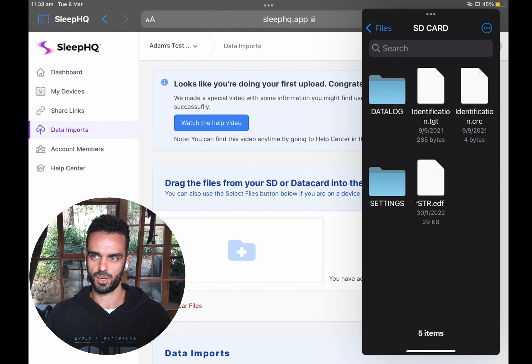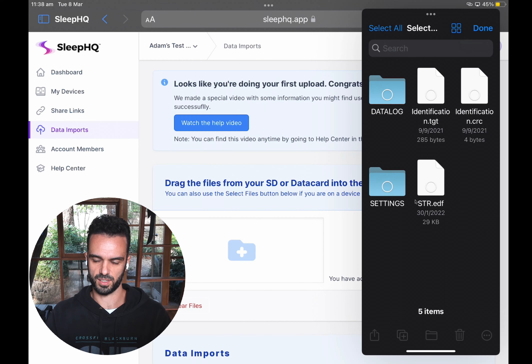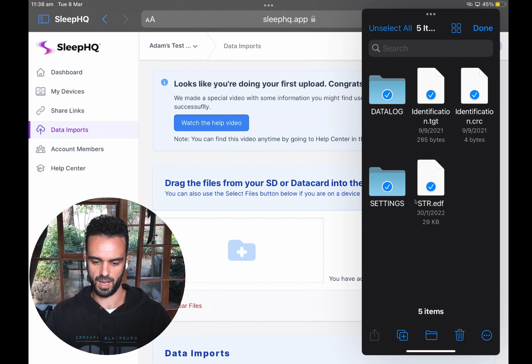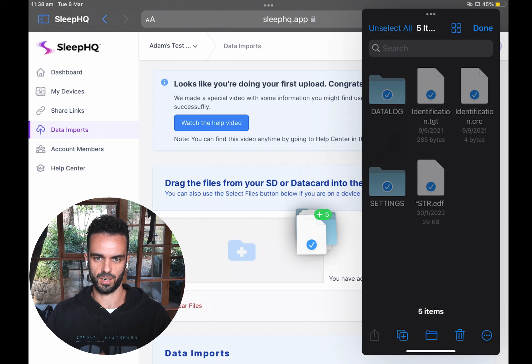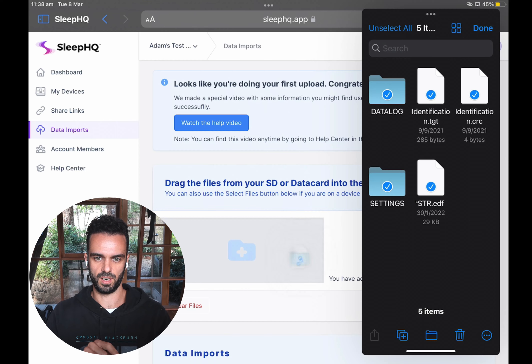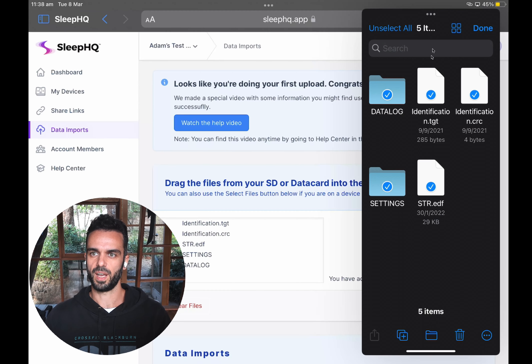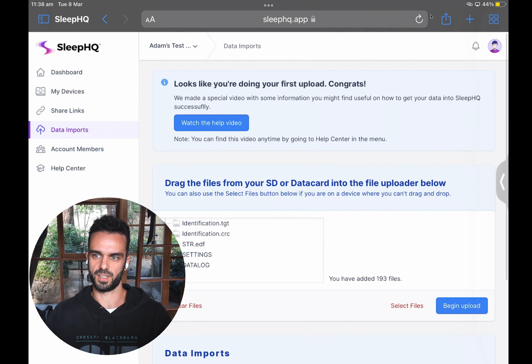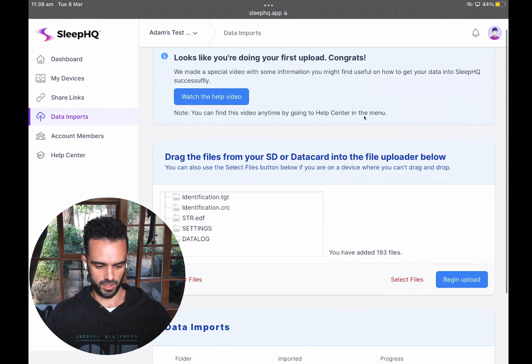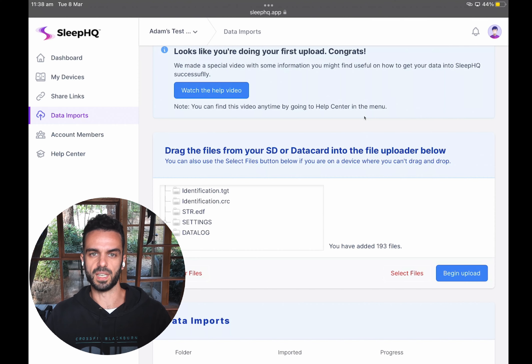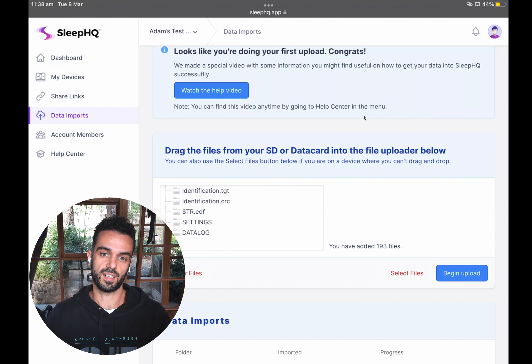Now I just need to select the files and drag them into Sleep HQ. I'm going to click the three dots at the top right corner, select "Select," then "Select All" in the left corner. Now I've got all my files and folders selected, and I'm going to hold and drag them straight across into the Sleep HQ window and drop them. Once that's done, I can click the three dots and swipe right to dismiss the file browser. In Sleep HQ I can see all the files and folders from my SD card have been added, and I can click "Begin Upload."